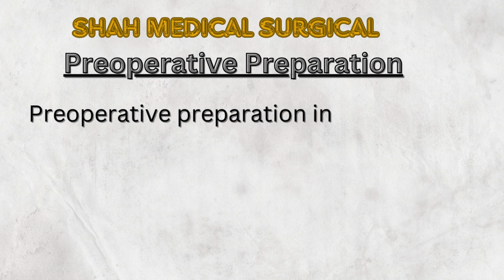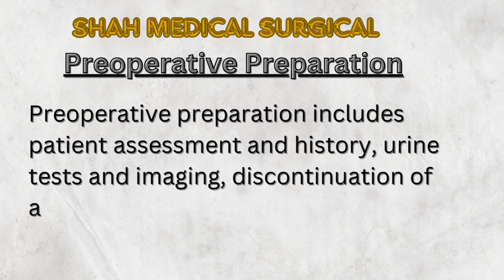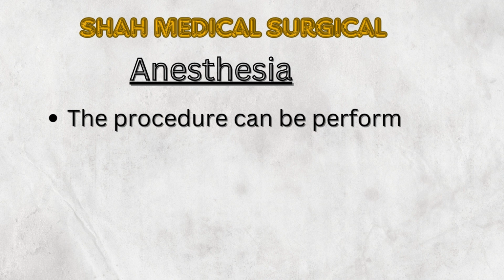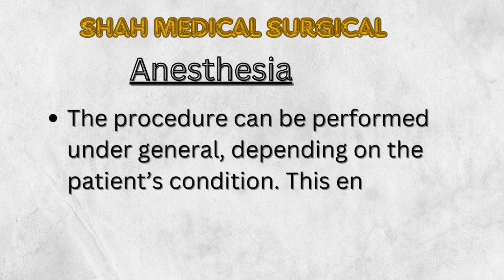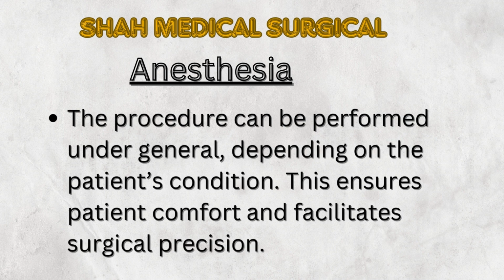Preoperative preparation includes patient assessment and history, urine tests and imaging, discontinuation of anticoagulants, and obtaining informed consent. Anesthesia. The procedure can be performed under general anesthesia, depending on the patient's condition. This ensures patient comfort and facilitates surgical precision.